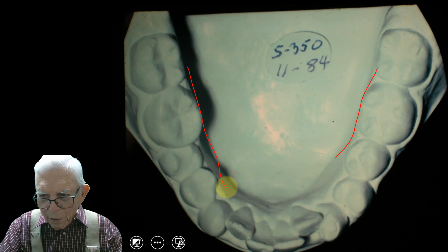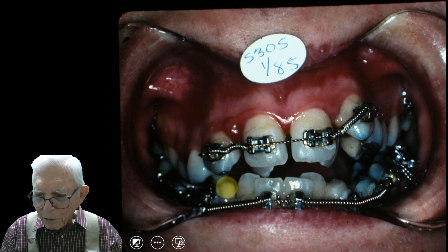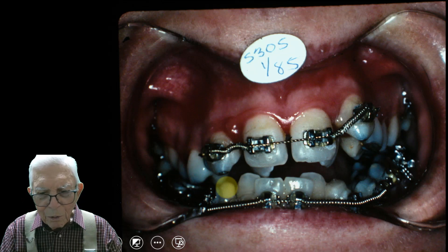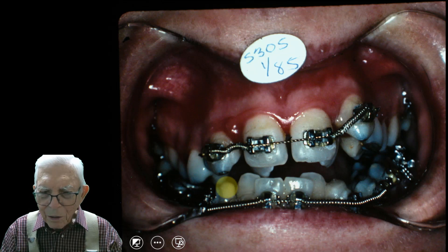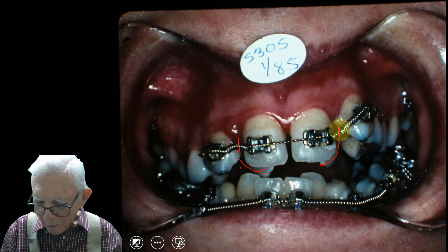We've got to spread this upper arch way out past the lower arch here. Now, I don't know how to tell you exactly how to do a case like this — just don't take one on unless you really know what you're doing. It's better if someone else does it. But you can take a case like this if you've done pretty difficult stuff. You might make it better than it is, but it's going to eat your lunch trying to finish it. On the bottom arch, we've got springs in here opening everything up and lining the teeth up. We're going to open this gap and bring this lateral tooth that's back in here, and this one between the cuspids and the laterals. That alone is going to help her looks a lot.